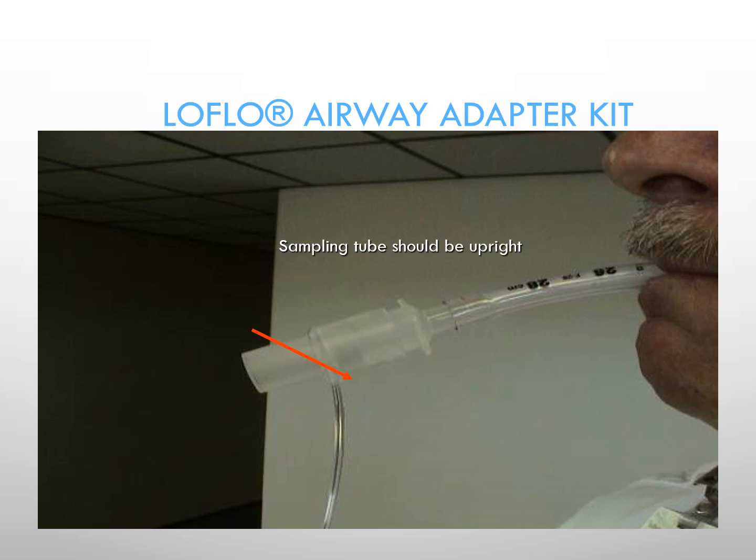And with this particular example here, obviously this patient is not connected to a ventilator, and this is illustrative, but it's showing you an endotracheal tube out of this gentleman's mouth, and it's showing you that the actual adapter, the end-tidal CO2 sampling tube adapter, is facing downward. So you can think about what can happen. Moisture. It may be moisture from condensate. It may be moisture from what the patient's exhaling. But it, again, could be condensate from the humidifier, etc. But irrespective, water gets in that tubing, it's going to affect the accuracy.